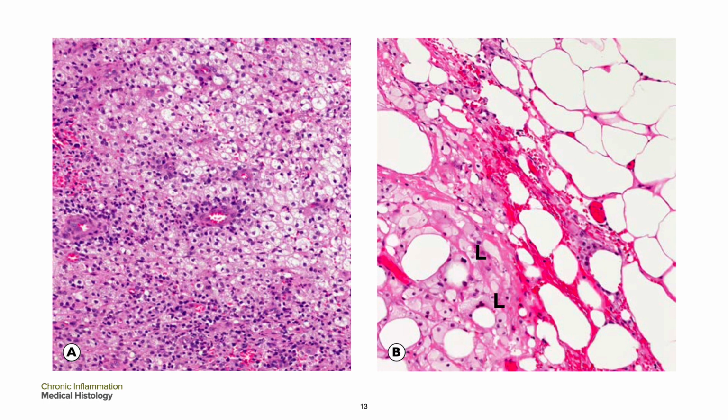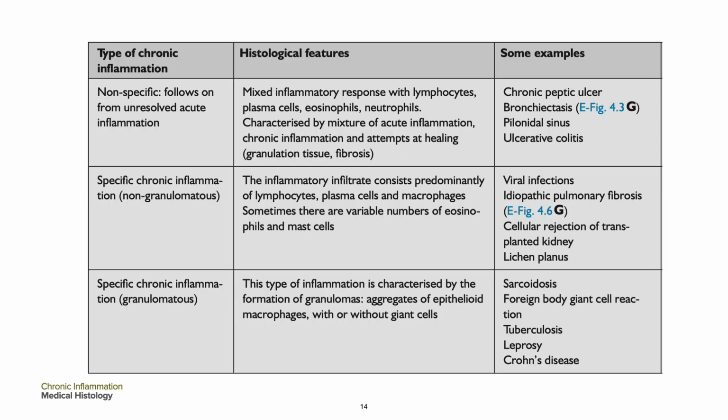Another much more common appearance is the accumulation of lipid-laden macrophages in areas where fat is released from adipocytes, often in areas of fat necrosis. Letter B shows such an area where necrotic fat cells are easily identified by their lack of nuclei. Occasional lipogranulomas in letter L may be seen, consisting of a droplet of lipid surrounded by foamy macrophages.